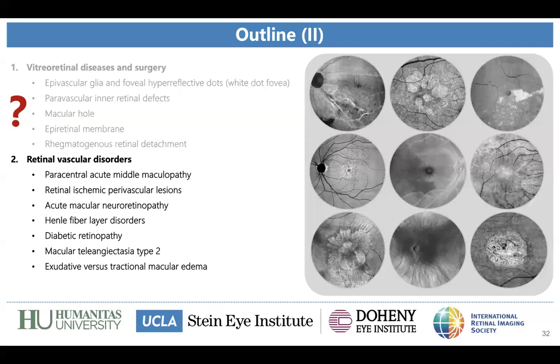But actually, I think that the possibility to manually adjust the slabs and avoid segmentation artifacts is pretty easy. I mean, we are talking about a non-invasive imaging modality that doesn't require dye. It only requires patient collaboration, and it's not even so long, just a few minutes. So I think this is a great point, but I think that manual segmentation and adjusting point by point for each layer that we are interested in is the answer in these cases.